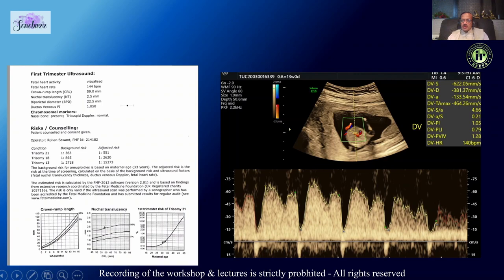It is not enough to look at the ductus venosus subjectively — we also calculate the PI. If you complete the FMF course on ductus venosus, nasal bone, and other markers, you can go to the site and enter your ductus venosus PI values along with NT, and get an adjusted risk.